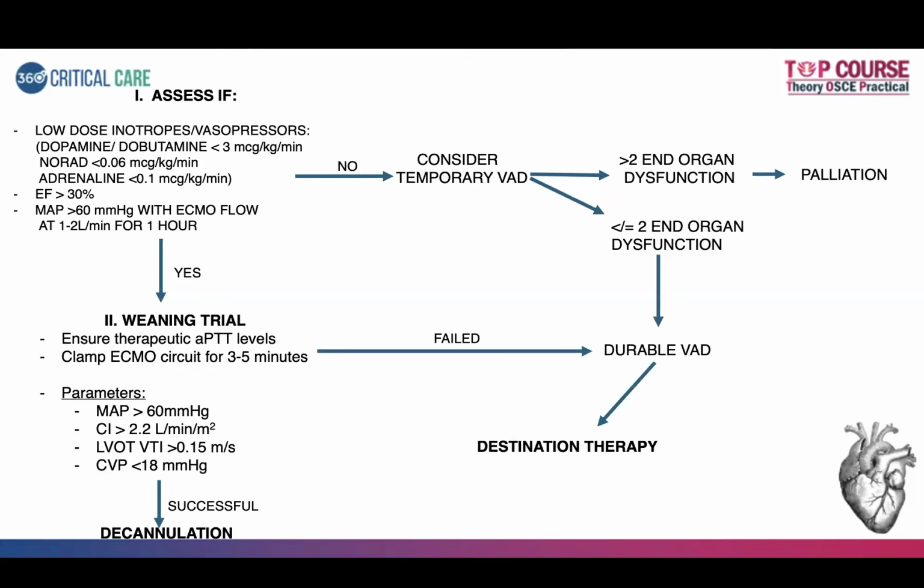So once a durable VAD has been placed, you can go into 2 fates. One is destination therapy or heart transplantation. And destination therapy is continuation of further care with the durable VAD.